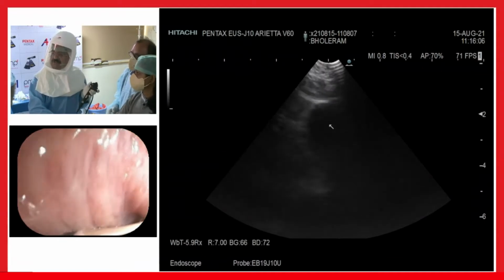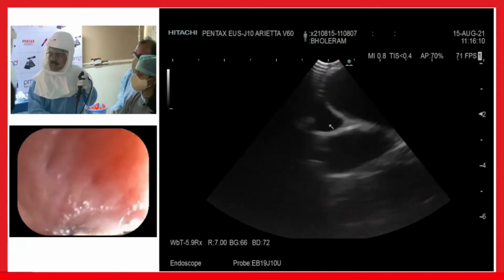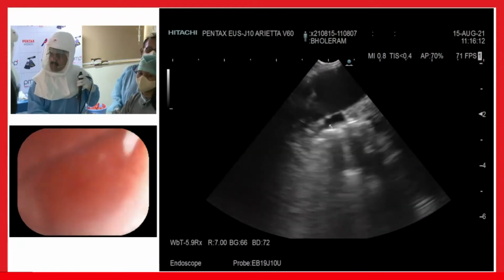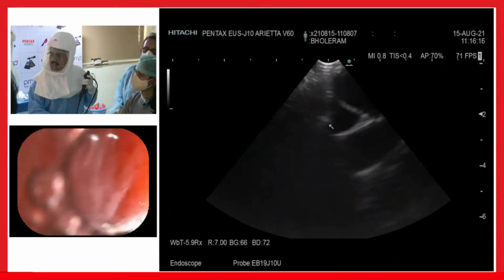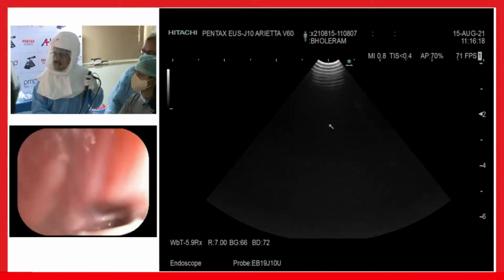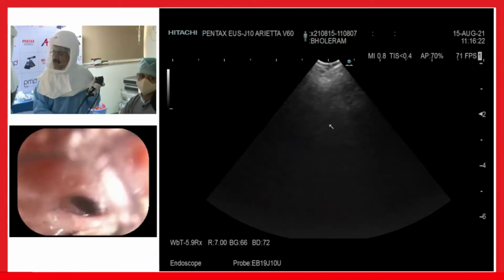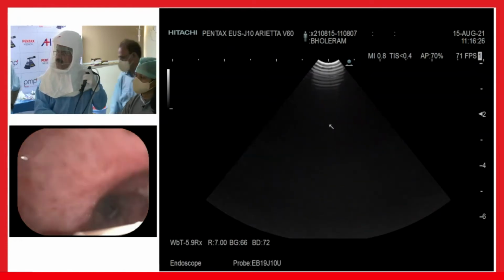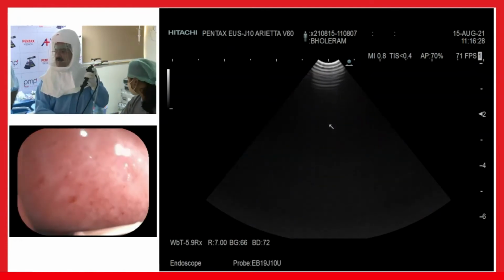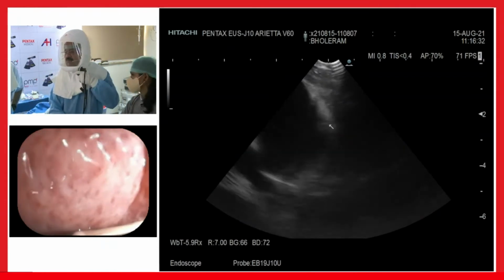Till then you can see here. I don't believe that these lymph nodes are important. What is the diagnosis originally? This is a CA, right upper lobe. Quickly remove it and we see if we can do it, because I don't believe you will have any pathology. Are they PET positive? Yes, PET positive. Then we can go ahead, because if they are PET positive, then this is okay. The PET positive lymph node in the subcarinal area.